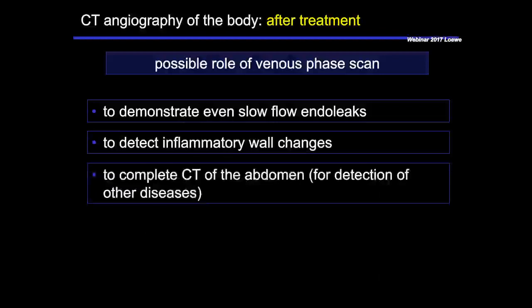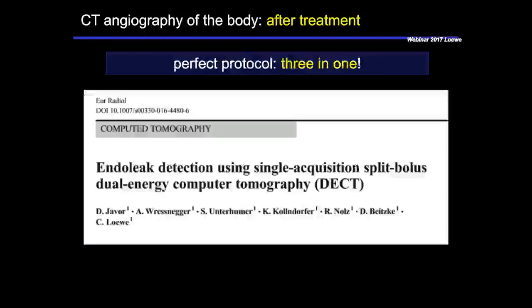Since the cumulative dose is really an issue, we tried to set up a protocol by really limiting the radiation dose exposure, and this has been recently published in European Radiology, and our proposal was to combine a split bolus contrast administration with the possibility of a dual energy CT acquisition.